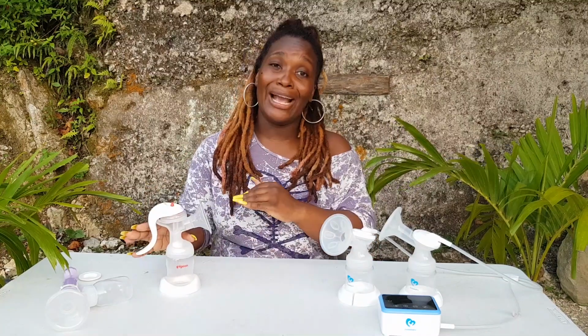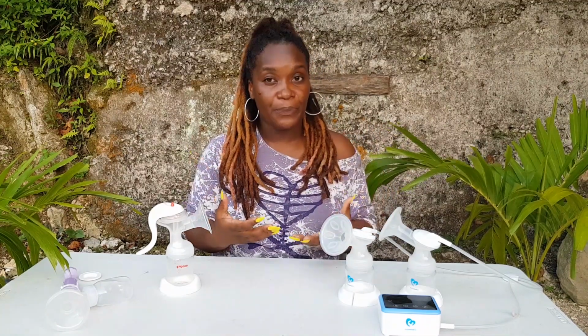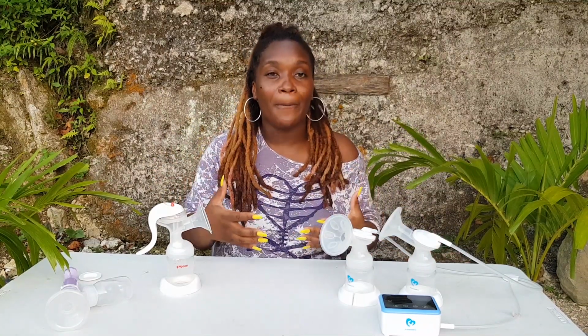at. However, if you're going to be pumping for 10-20 minutes and you're going to be doing this every 2 to 3 hours per day, it might not be a good pick to go with a manual, when with an electric pump, you literally put it on your breast, sit there, and it pumps it for you. And especially in the nights when you're tired, and some persons, their letdown comes more at night, it's probably going to be a little bit strenuous if you have to pump a lot of milk. So you have to consider those things.